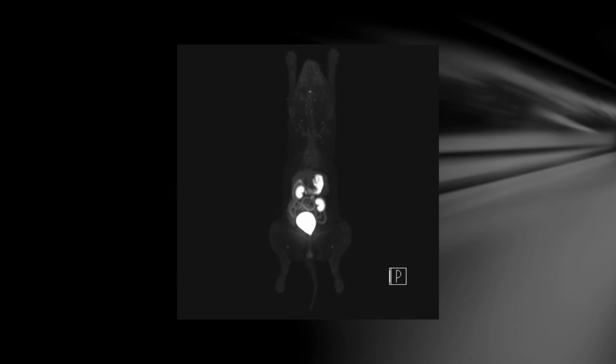Just to finish off, I'll just show you this slide, which is, I think, what a lot of people think of when they hear the term PET-CT. This is a dog that we scanned at Mercy, because dogs get neuroendocrine tumours too. This patient was having investigation for an insulinoma, which is a pancreatic neuroendocrine tumour. But this is not what we're meaning when we ask you about having a PET-CT.